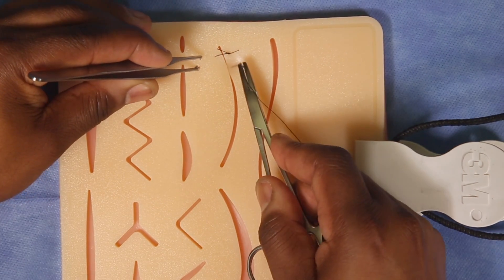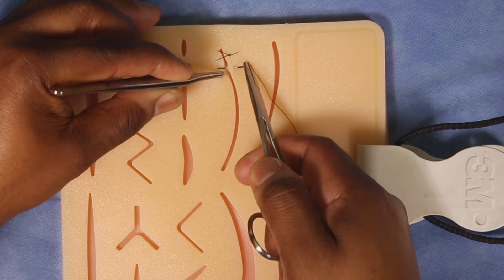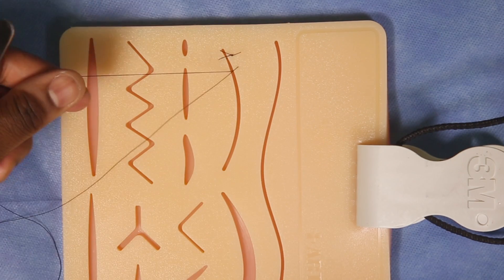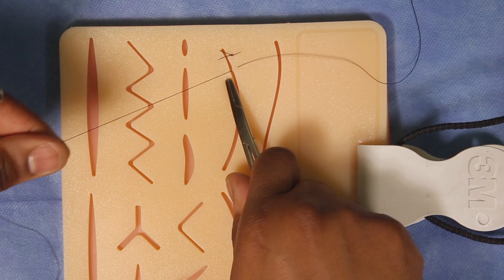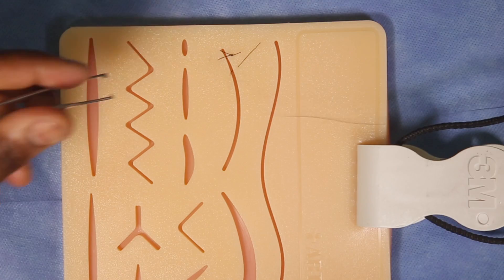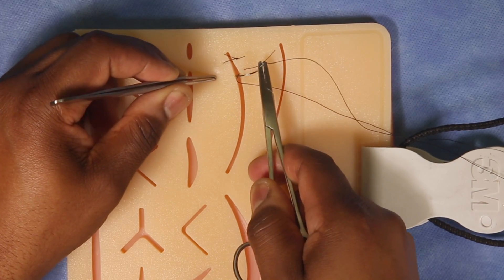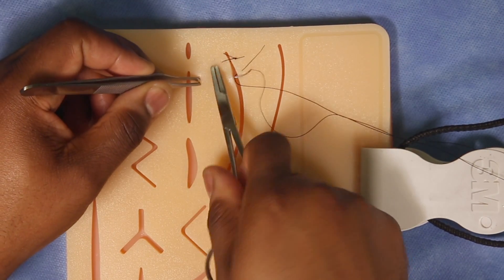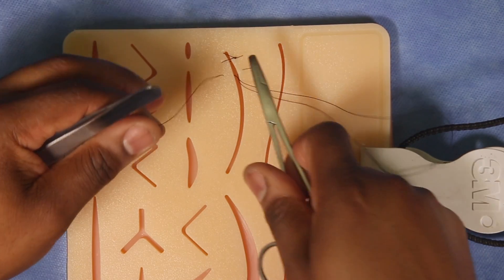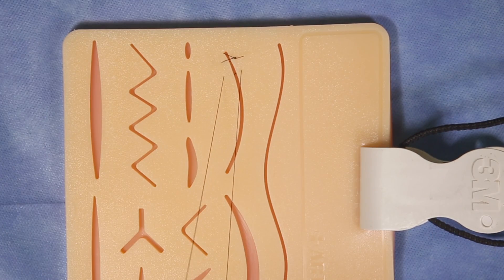A few millimeters from the skin edge, you can take it in two bites or one bite. I decide based on whether I can get through the skin in one bite — if not, I'll take two. Make sure you take the same depth as well as the same distance on the other side of the wound.